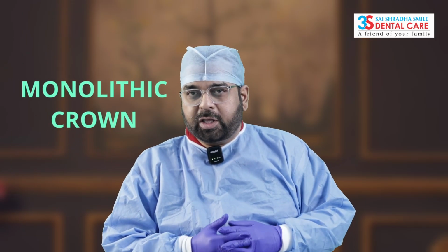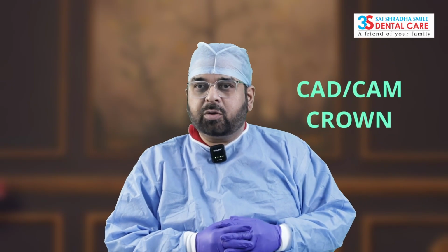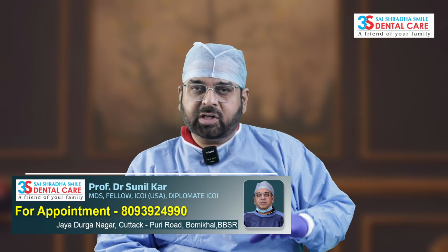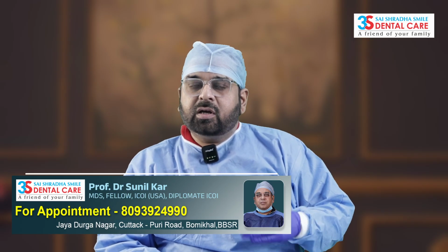So the technique of manufacturing also depends, and it makes the crown successful. Nowadays the most common are monolithic crowns and CAD-CAM crowns. CAD-CAM crowns are the most commonly used right now because of their precision and perfect fit. And right now there are digital crowns. We scan the tooth and go for digital crowns. The fit and precision of digital crowns, the perfect occlusion and the marginal fit, are the best. Whether you are using titanium, gold or any material, the digital crown is a different technology which is used right now.